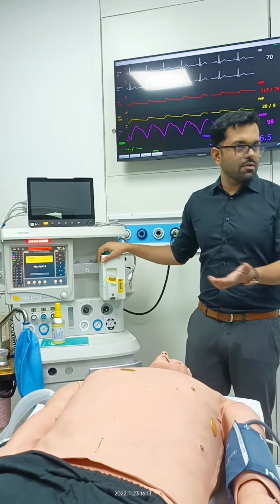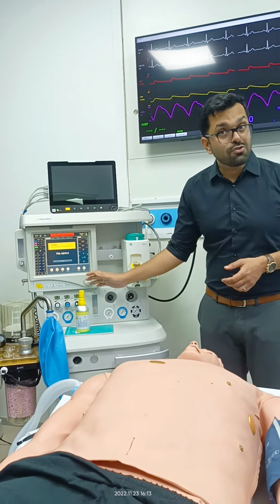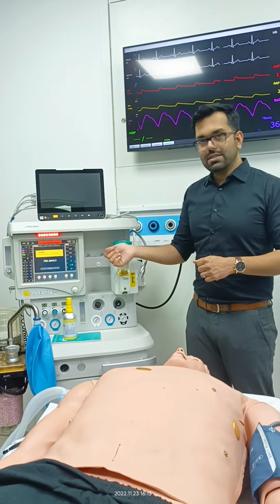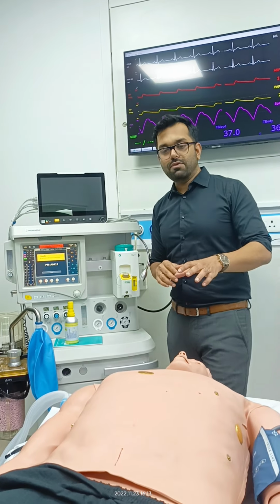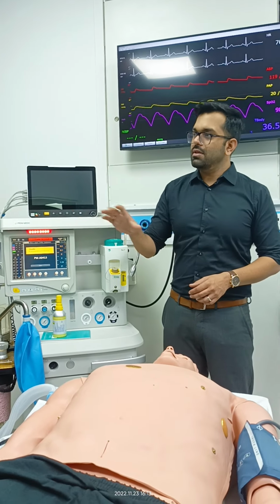How can we use this for maintenance? We keep it near MAC along with a mixture of oxygen and air to maintain the anesthesia. Now this will keep your patient anesthetized, sedated. But the gases that we're using don't have muscle relaxant. We need to make sure that the patient is not breathing, because if the patient starts to breathe on their own, they're going to fight with the ventilator, because the ventilator is set at a certain rate.